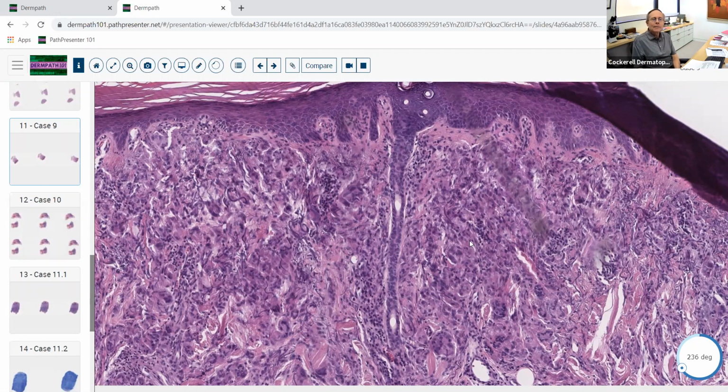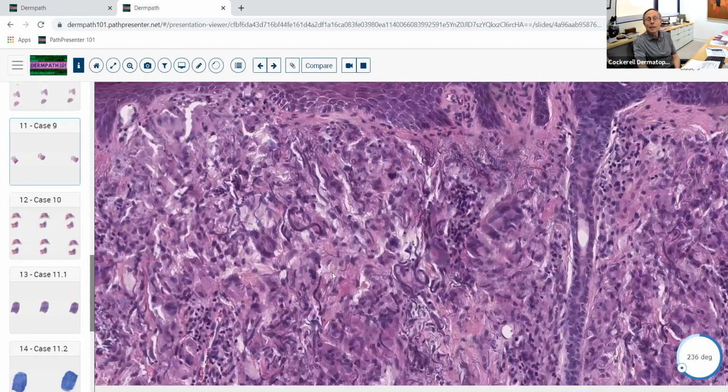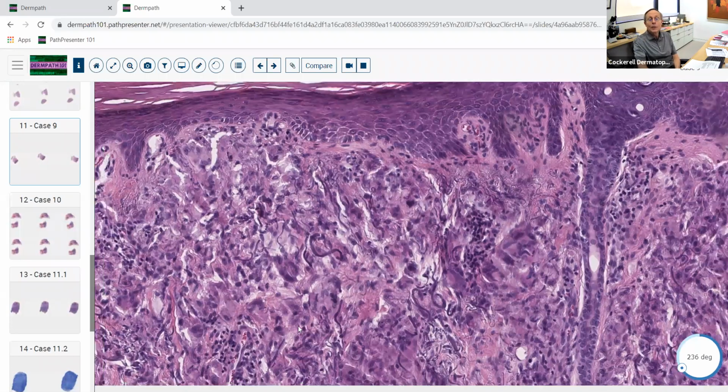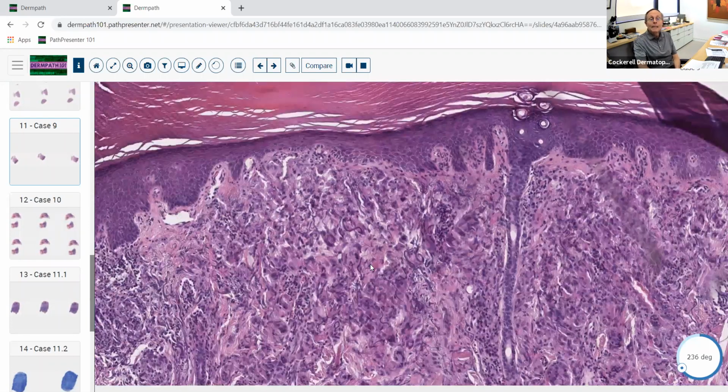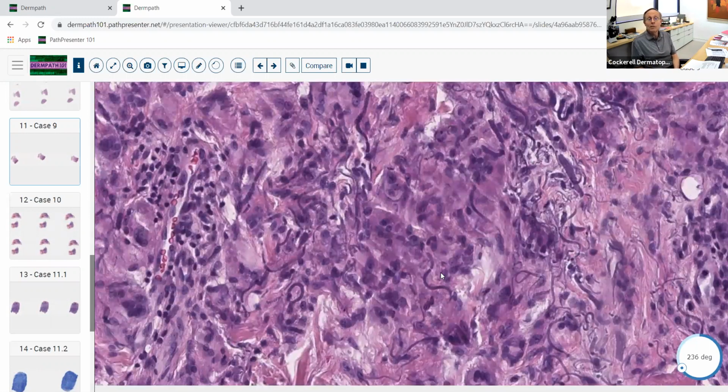And basically what this probably is, and I don't have any definite proof of it, but the way I was trained is that it's probably a variant of GA occurring in an area where there's just a lot of sun damage. I don't know for sure if that's true. It could really be that the elastic fibers get damaged by solar alteration, they become immunogenic, and then the host comes in there and puts in all these multinucleated histiocytes, starts engulfing them, and then you get a granulomatous inflammatory infiltrate. So, if you see actinic granuloma, this is what it looks like. It basically shows these histiocytes that engulfed all these elastic fibers.